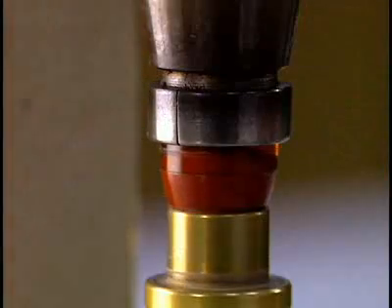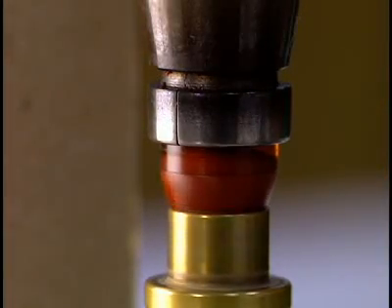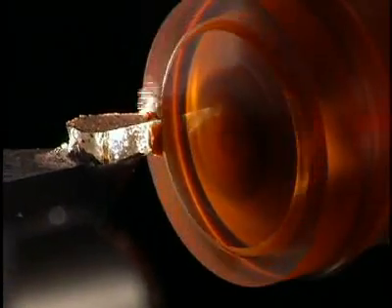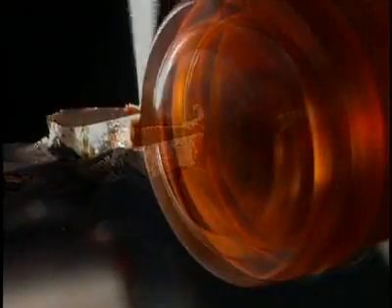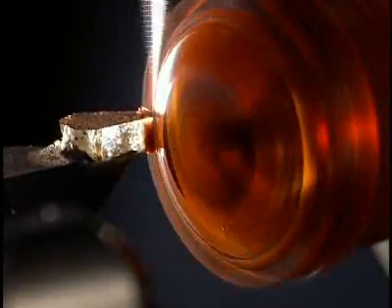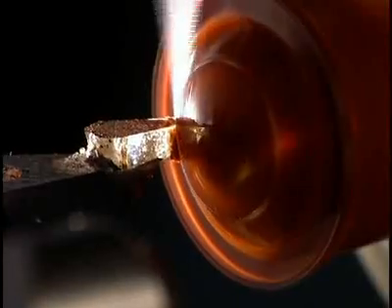The wax takes on the desired shape in just seconds. The comfort of a lens is also determined by its thickness — it must be as thin as possible while retaining sufficient solidity. They begin by shaping the outer diameter of the lens, which takes only a few seconds.